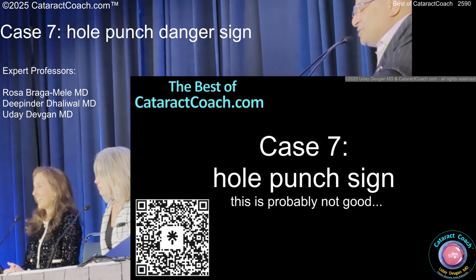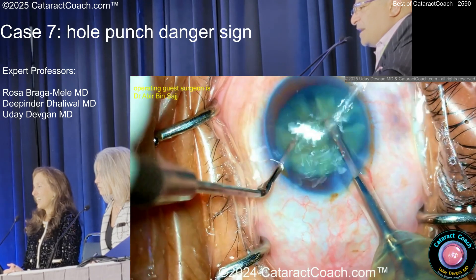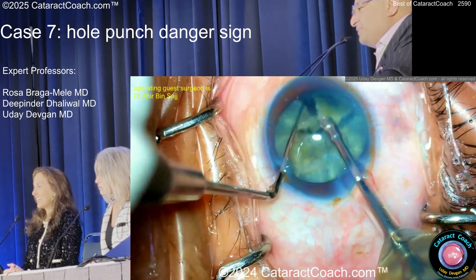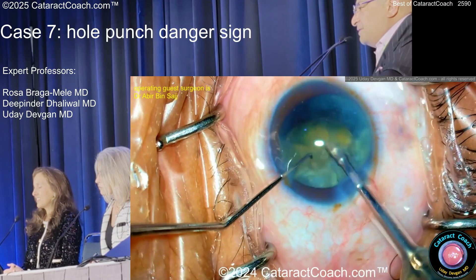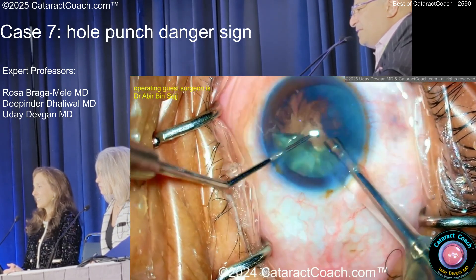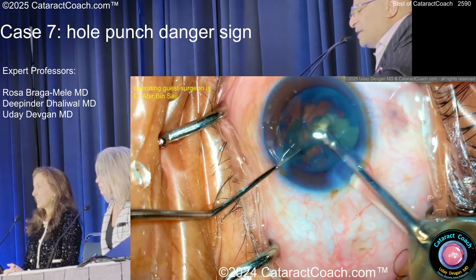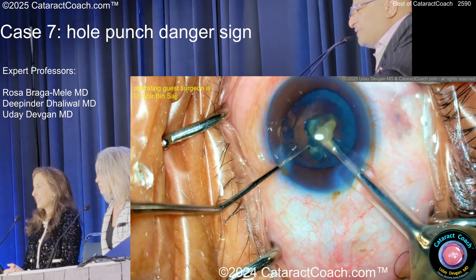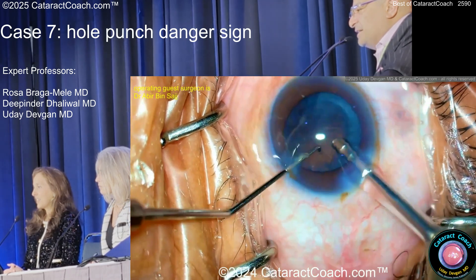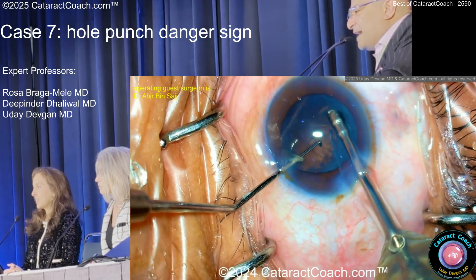Hole punch sign. This is probably not good. We've got an experienced surgeon here who's operating and chopping up the nucleus — good job, very talented — and cleaning that up pretty nicely. At the end, the key is watch out for that hole punch sign. The surgeon's operating very fast. If I slow it down, you'll see trying to get that epinuclear shell out, which is super thin, and then you're just trying to vacuum through it.